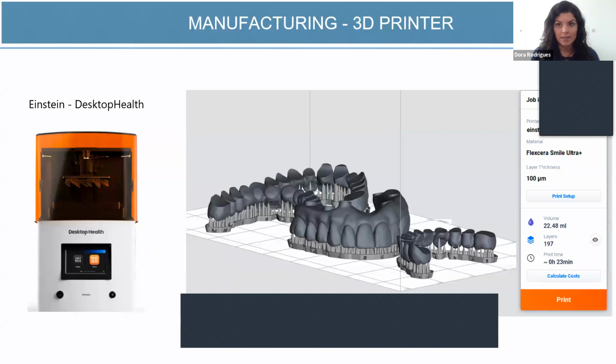And like I said, I have other printers that are good, but they might take up to 40-ish minutes to print this exact same restoration. We're talking about timing. When the patient is in the doctor's office in the chair waiting for the restoration, we need to be very efficient with time with this type of cases.